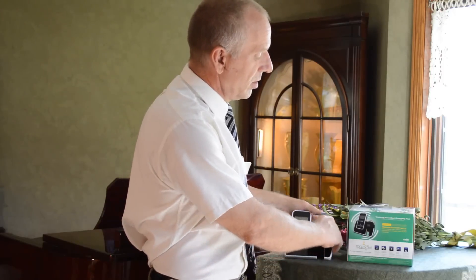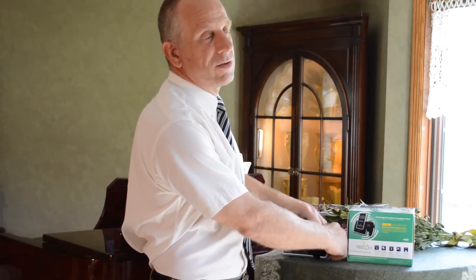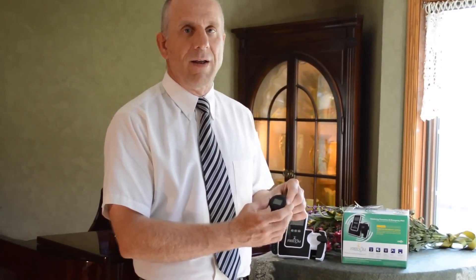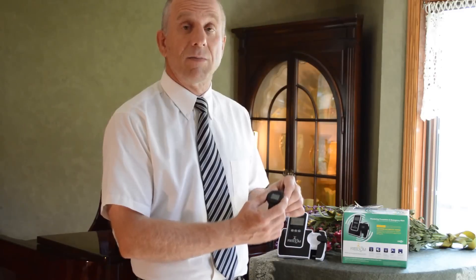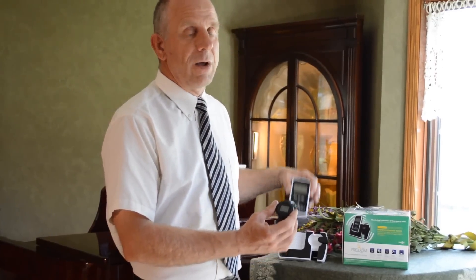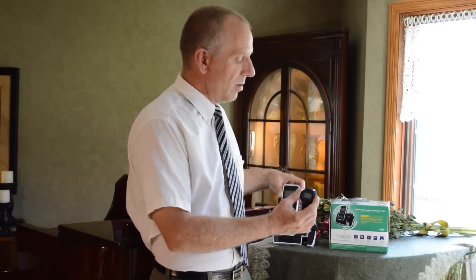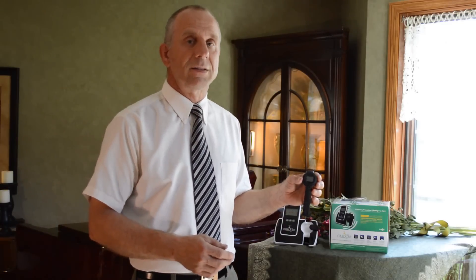The watch looks like a watch, feels like a watch, so therefore it wears like a watch. It's got the time displayed on it. It's not backlit because of the battery life. The battery life is up to 30 days if we stay within the radio frequency. If you have other devices on the market that are strictly GPS, you'll have to charge that watch every 24 to 48 hours. This is the game changer with this watch.